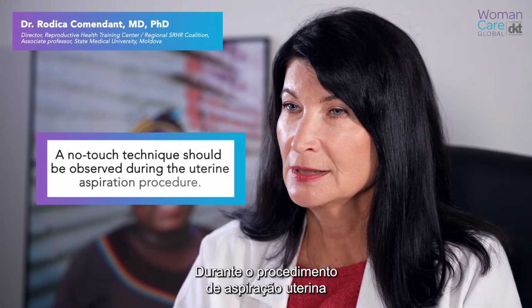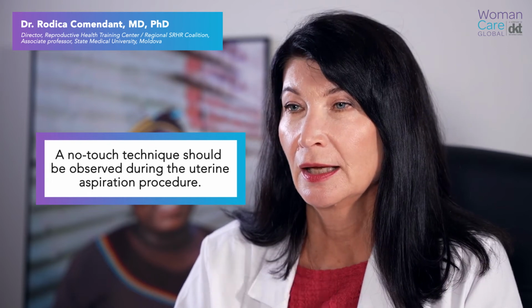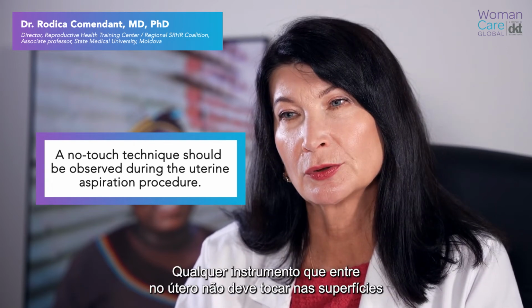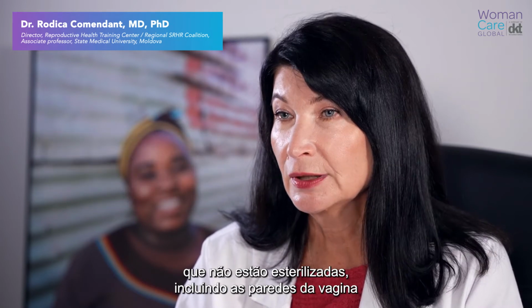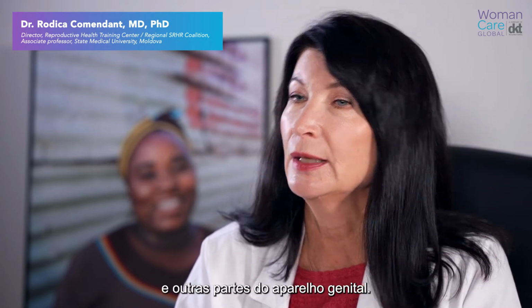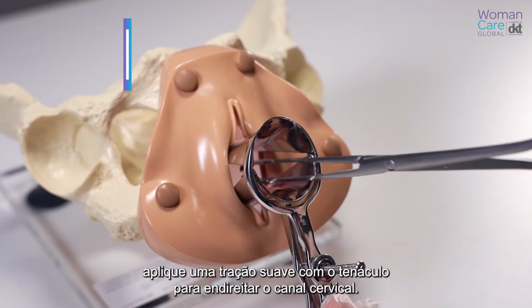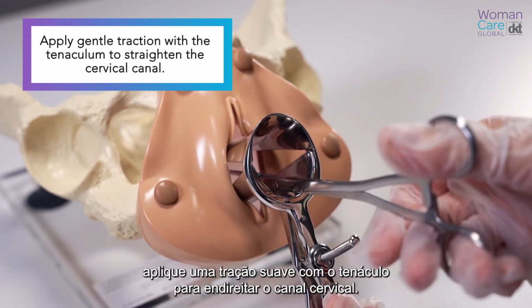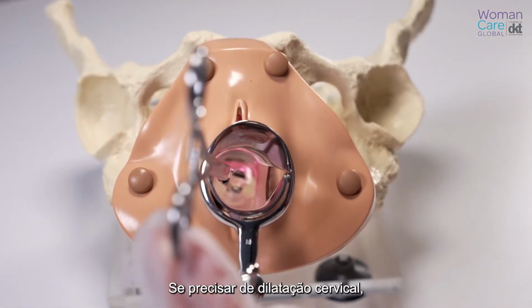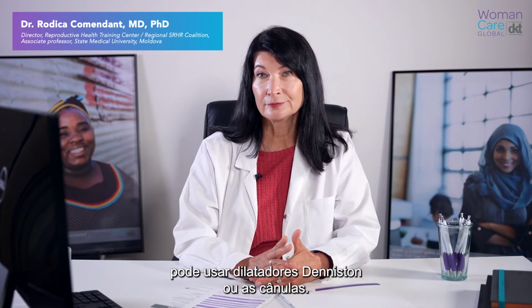During the uterine aspiration procedure, a no-touch technique should be observed. Any instrument that enters the uterus should not touch surfaces that are not sterile, including the vagina walls and other parts of the reproductive tract. With the speculum still in place and after paracervical block, apply gentle traction with the tenaculum to straighten the cervical canal. If you need cervical dilation, you can use Denniston dilators or the cannula.